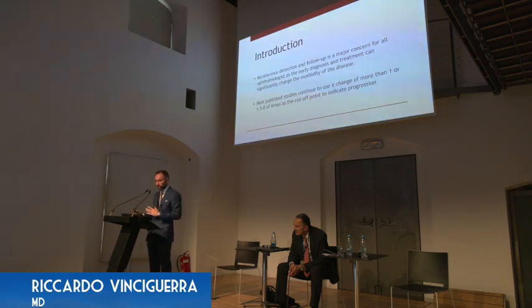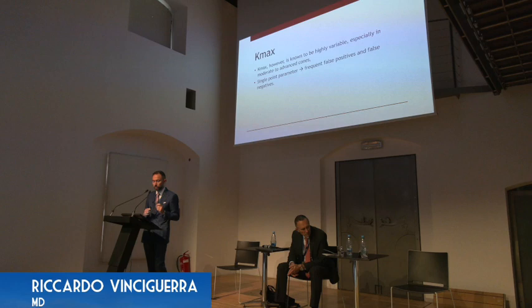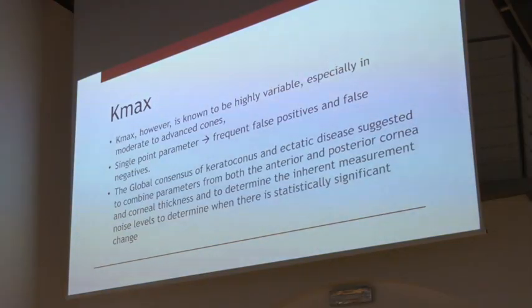So starting from this, Kmax is incredibly variable, particularly in moderate to advanced cones. It's a single point, so you have frequent false positives and false negatives.